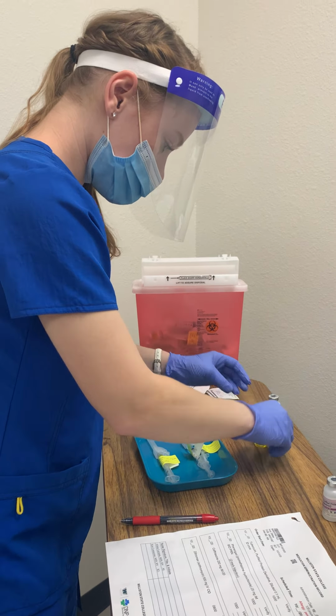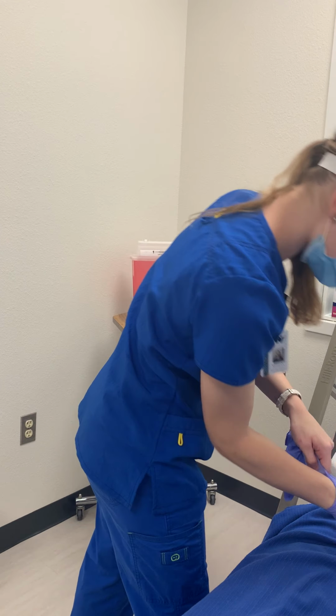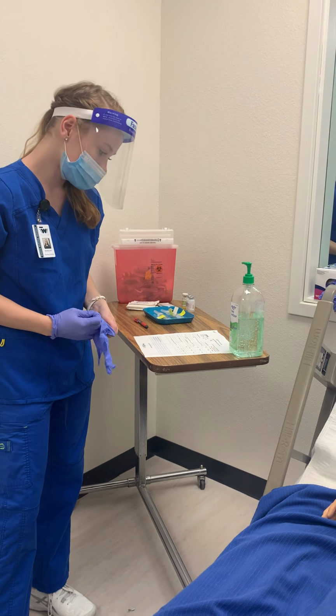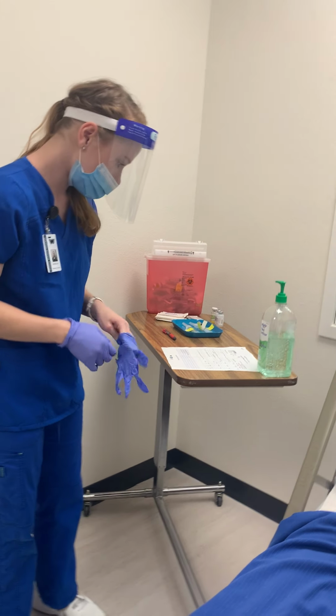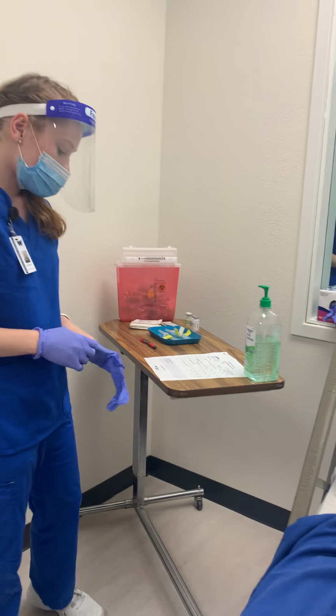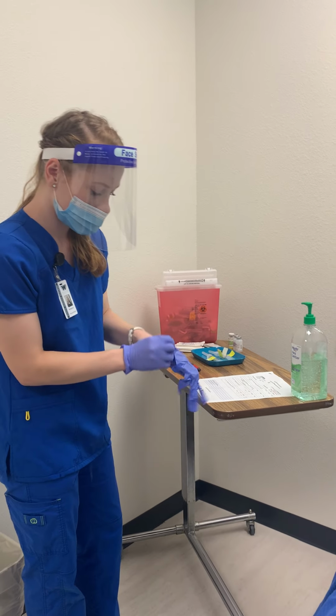But Shirley, can you tell me your date of birth? Here. Get a new glove. Okay, so you said 4/3 of 1987. Okay, let me just double check your wristband. Perfect. And then Shirley, do you have any allergies? Oh, you do. Okay, penicillin and furosemide. Okay, because I see your wristband and it's here on your chart. So I'm not going to be administering anything with that today.